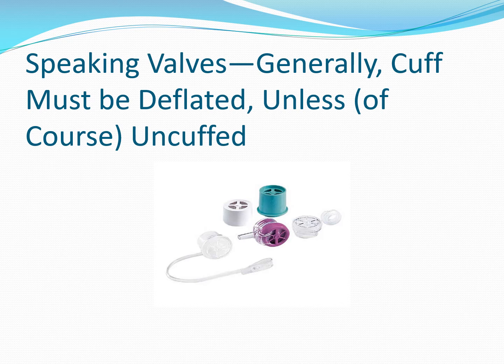The patient can breathe in through the tube, but when they breathe out, it does not allow air to come out through the tube. Rather, it goes up to the vocal cords so the patient can, as I said earlier, speak.